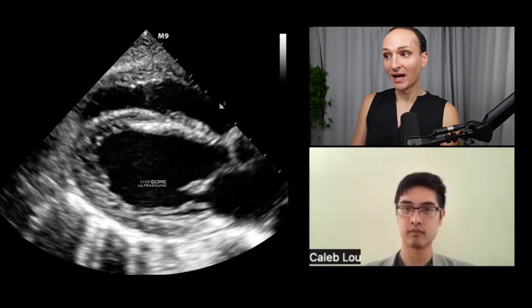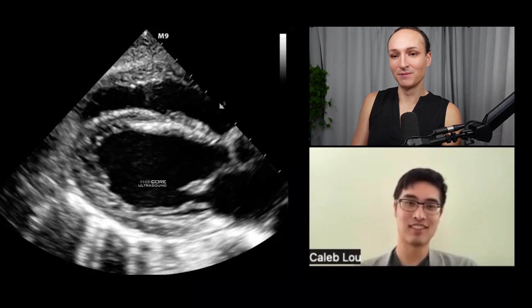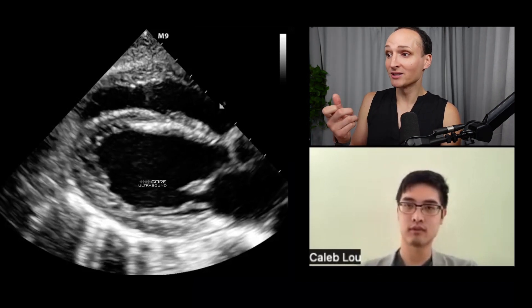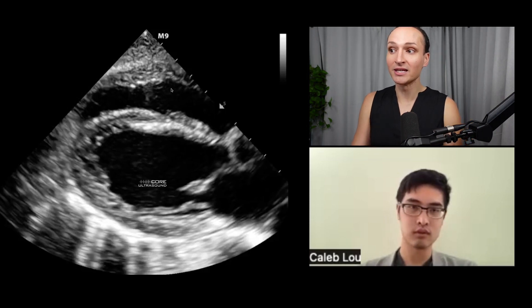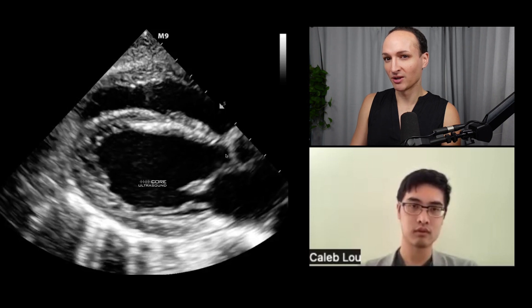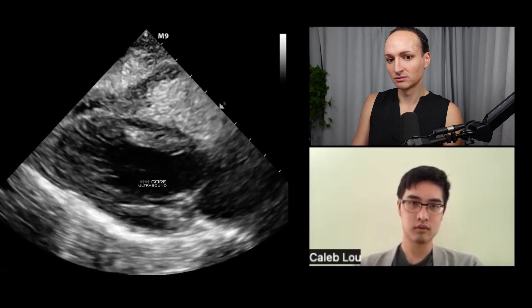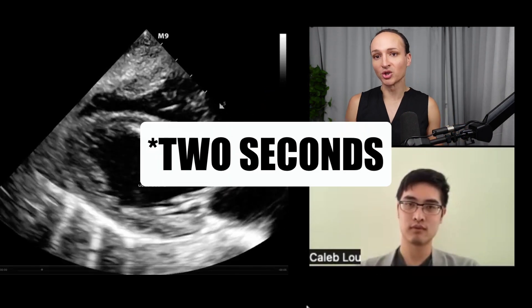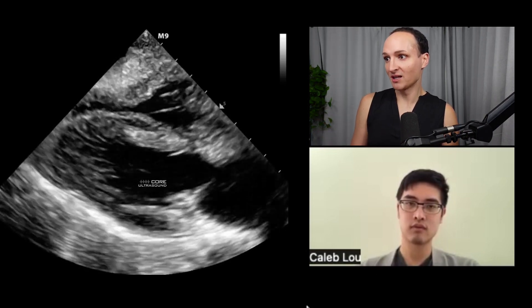We can confirm placement of a central line in the right place using ultrasound — we don't really need an x-ray. If you inject into the red port — subclavian, IJ, or even femoral — a big push of saline, agitated saline, or the patient's own blood, and you see turbulence within two seconds in the right side of the heart, that confirms the line is in the appropriate location in the SVC. Here in the parasternal long axis view, we have the left atrium, left ventricle, aorta, and the right side of the heart — watch how it becomes almost opacified like contrast is in there.